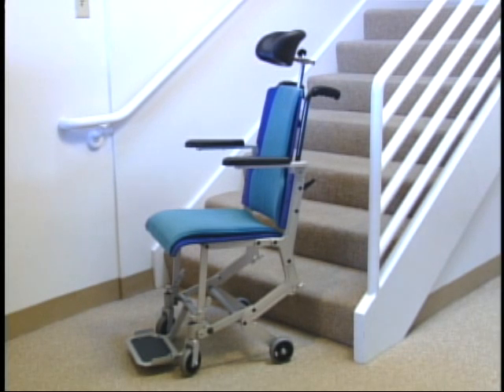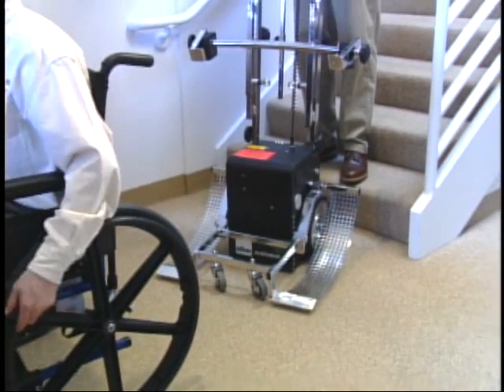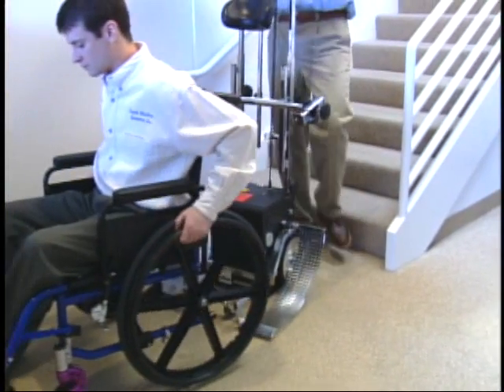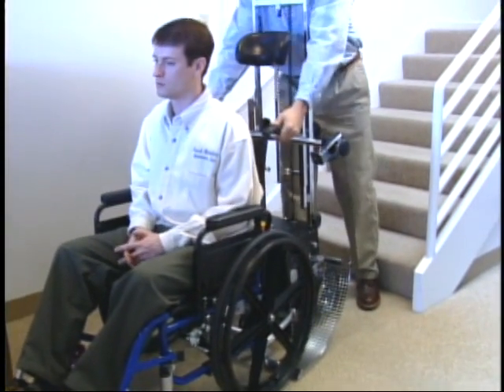The Scatterchair is a transfer chair that, when combined with the Scattermobile, provides an alternative stair climbing solution. Optional headrest and push handles are shown. The Scatterport was specifically designed for use in public areas such as nursing homes, museums, and schools where stair access for multiple users is needed.